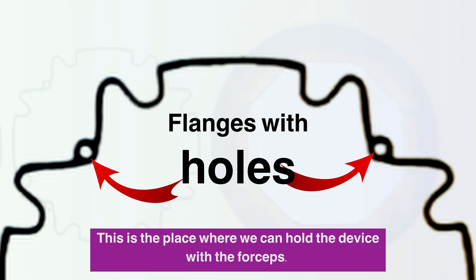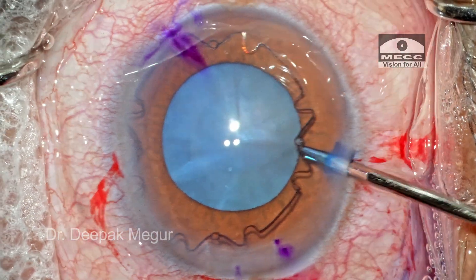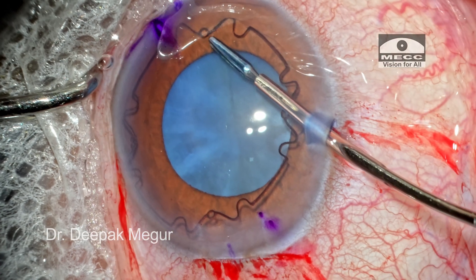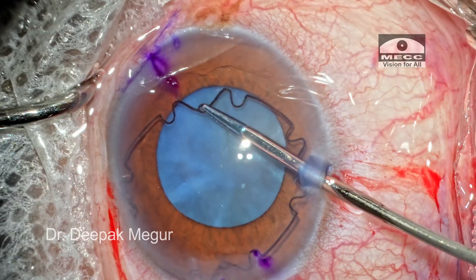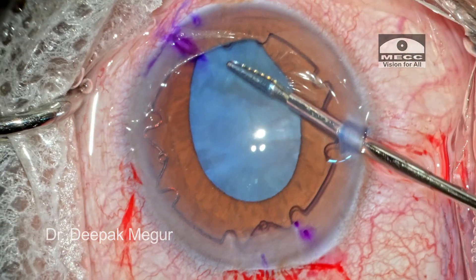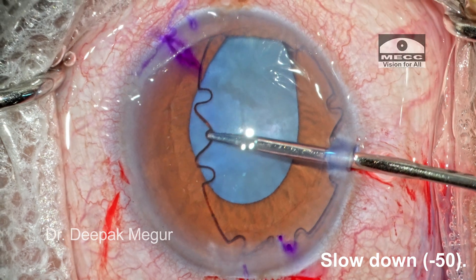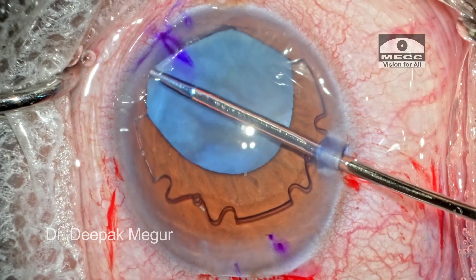This small hole is the place to hold the device with the forceps as it is being maneuvered. This is my first case, but the strategy remains the same. I prefer the side port for all maneuvers and use the B-hex forceps. I begin by holding the central hole within the W. The forceps pushes this part under the iris, engaging the two side notches against the pupillary border.